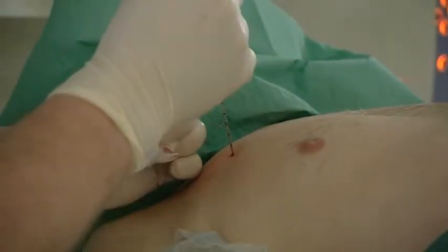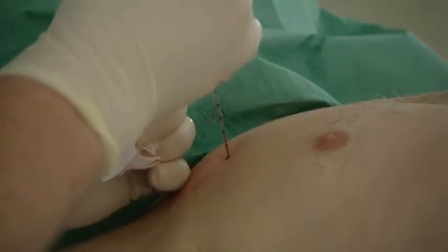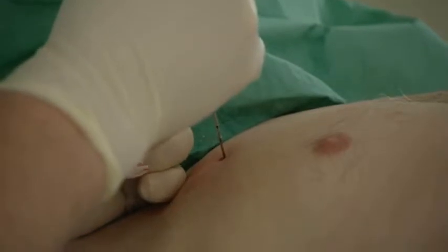The needle is then advanced to the target by keeping the laser dot at the hub of the needle. Please notice how the needle is advanced in one step to the appropriate depth, without the need for in-between control images.